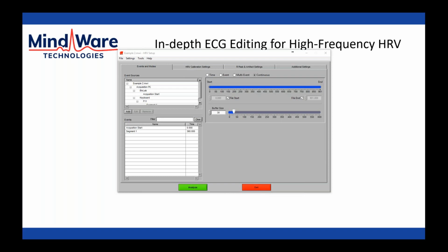So even if you're seeing an R peak identified properly, but you're seeing some other indication of an arrhythmia, whether that's a widened QRS complex or the absence of a P wave or an abnormal T wave, or just an extreme change in timing, most likely what you're going to need to do is delete that R peak and midbeat it. There are going to be instances where valid R peaks are still flagged because there's just an abnormal amount of variability for that particular beat to beat timing. And in those situations, you sort of have to make a judgment call. It's a little muddy in terms of exactly what you need to do.